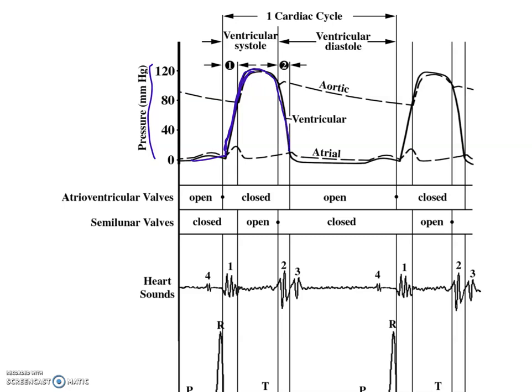So down here, you have the QRS. QRS would have to happen first. And then once the heart has been depolarized, the myocardium, then you can build up pressure. So you'll be right here. The T wave, which represents the repolarization of the ventricles, that one actually coincides on a mechanical basis directly here with maximum pressure in the ventricle.